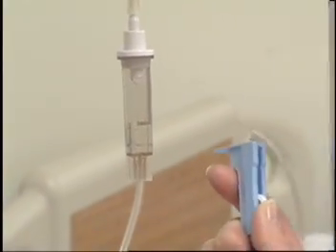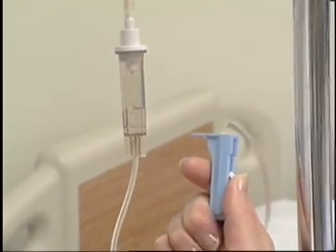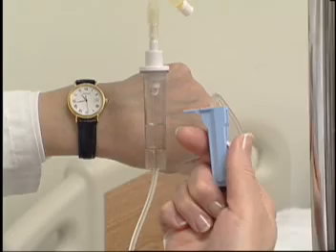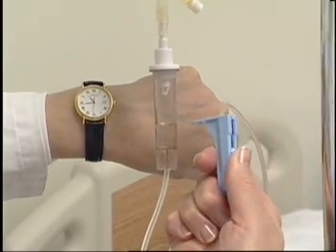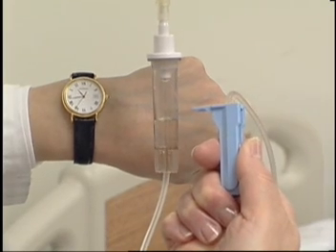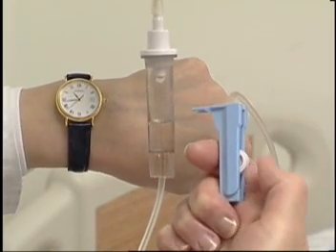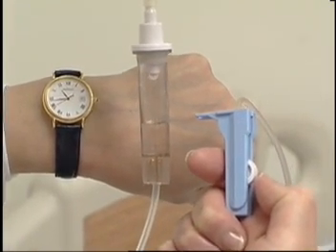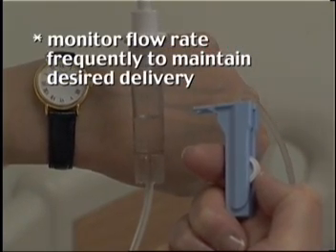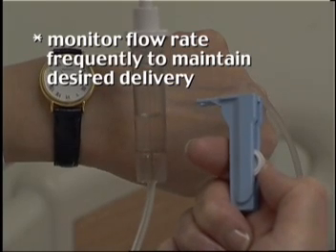Slightly open roller clamp, then, observing drip chamber, count the drops in 1 minute, or 15 seconds, and multiply by 4. Adjust roller clamp to desired number of drops. Monitor flow rate frequently to maintain desired delivery.